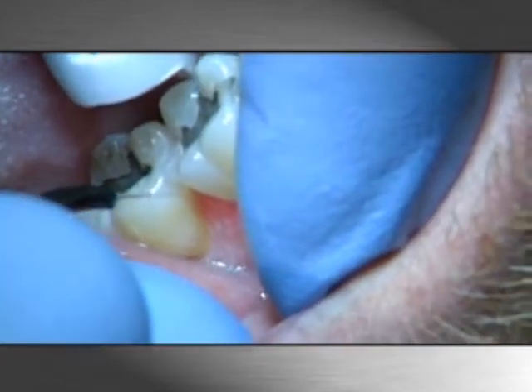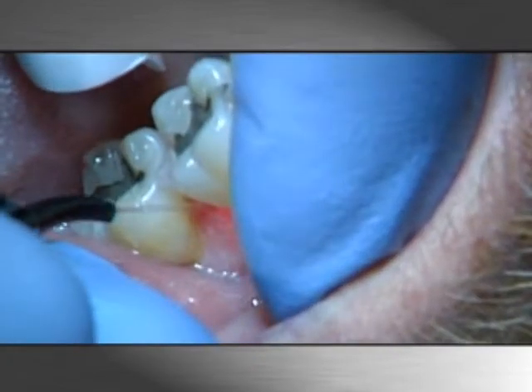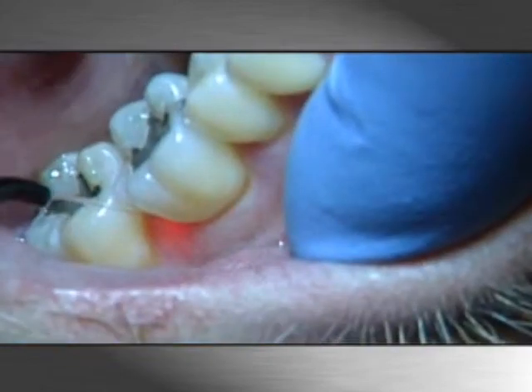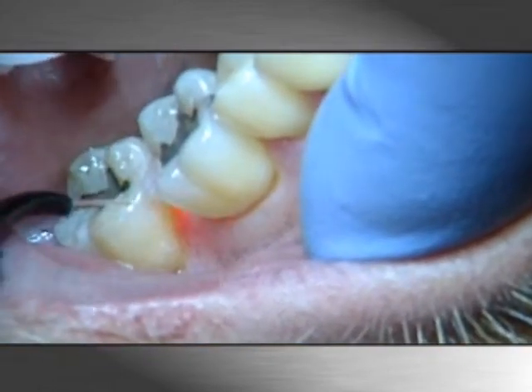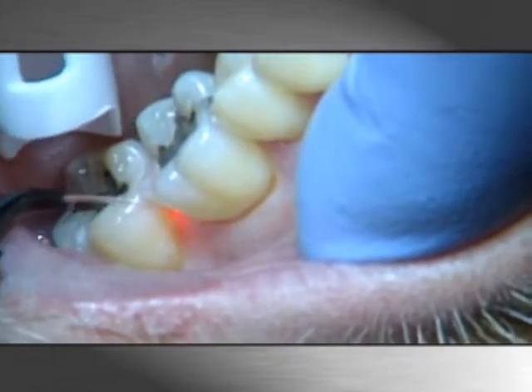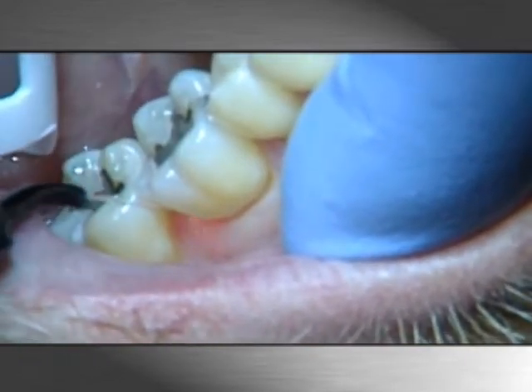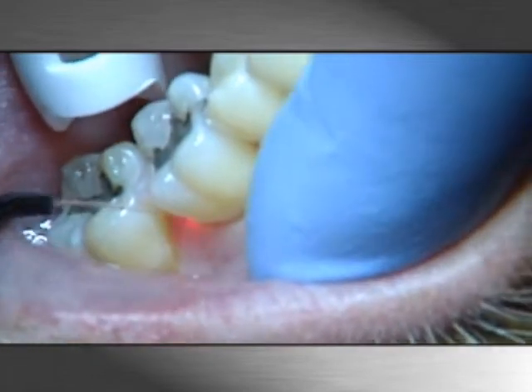Always use the lowest amount of power necessary to reach the treatment objectives. Keep the fiber parallel to the root surface during lasing, or with the tip slightly tilted toward the gingival tissue in order to maximize ablation of the inflamed tissue. Keep the fiber tip in contact with the epithelium.